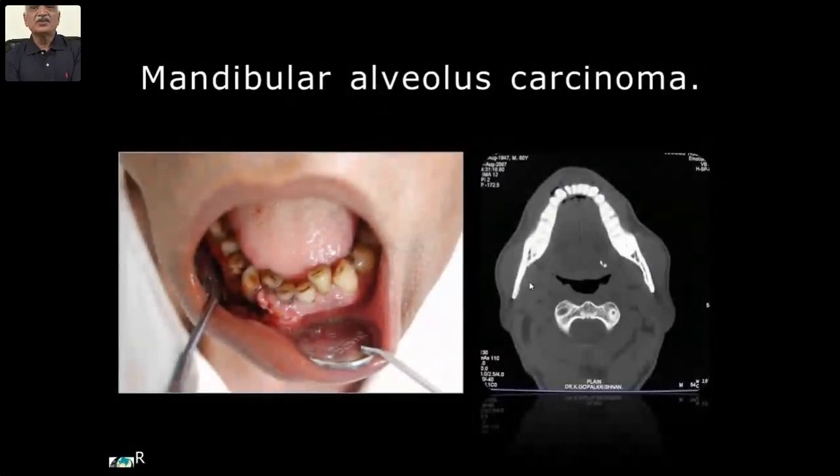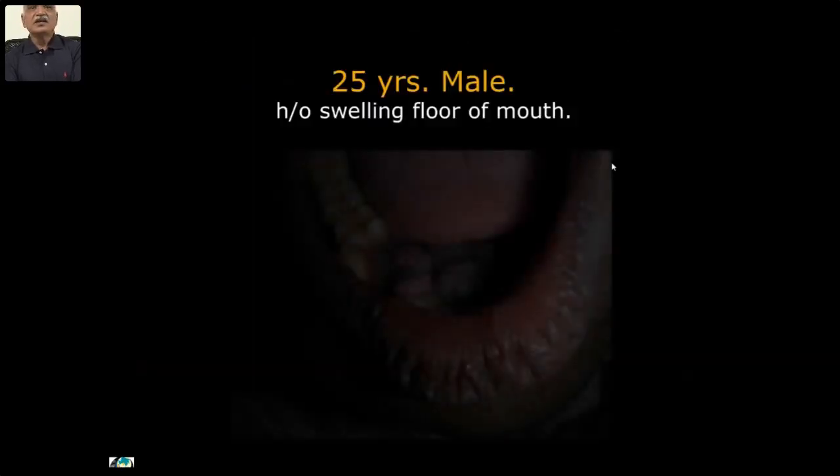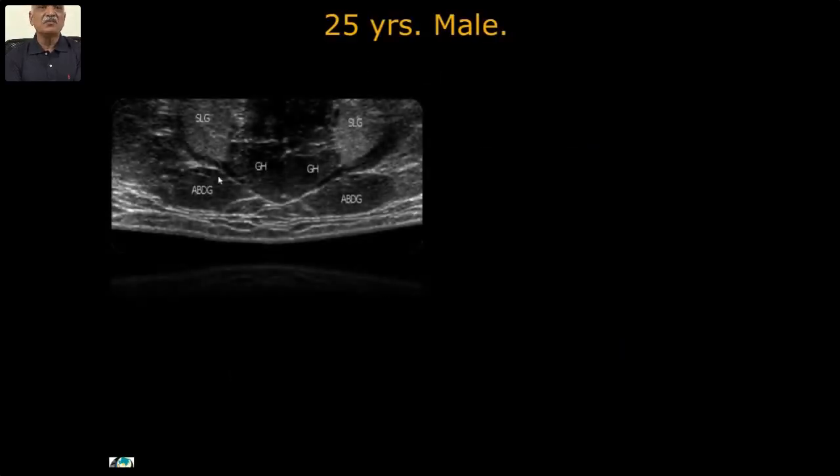Alveolar carcinoma: unless you take very thin slices, cortical margin evaluation for destruction is very difficult. But here you can see the cortical margin is destroyed with the underlying growth. Another case: already proven malignancy — clinically and on ultrasound — and this is a normal versus abnormal submental area.